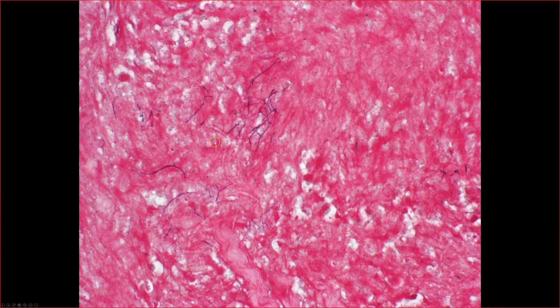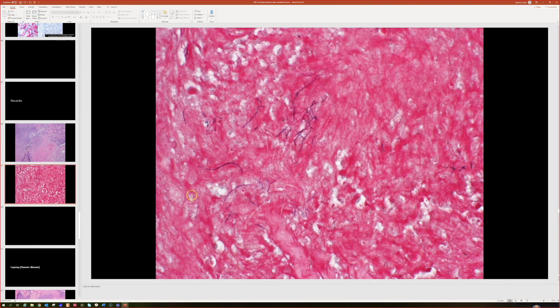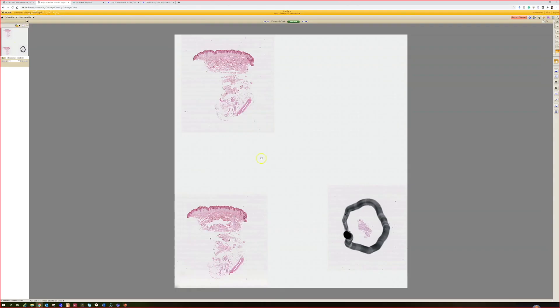Although I tried the acid-fast stain in this case and it was difficult to work with, the culture grew out Nocardia. So this is one of the rare times I've actually seen Nocardia. As you can see, there are a lot of organisms, but they're not making the mycetoma sulfur granule, at least not in this case. So that's Nocardia.